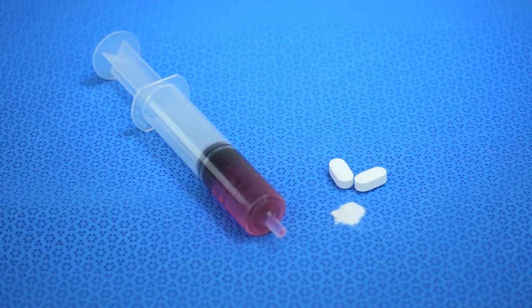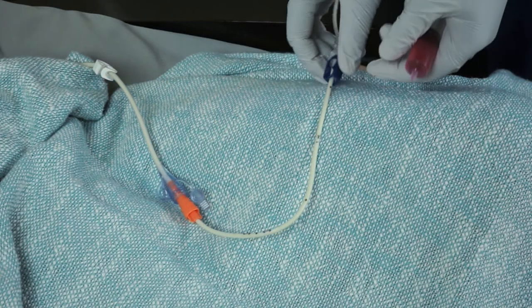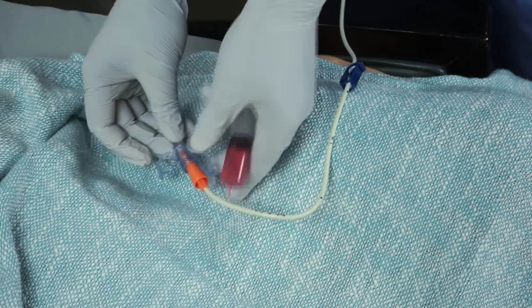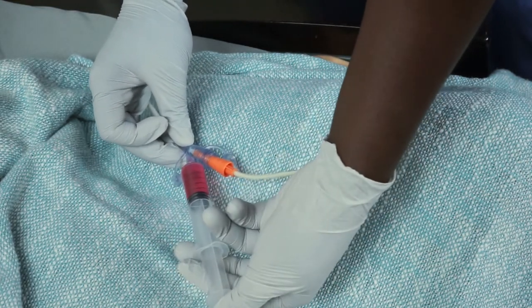When administering medication, use the access port on the feeding tube if possible. Close the blue clamp before opening the feeding tube access port. Administer medication and wait five to ten minutes before reopening the blue clamp.